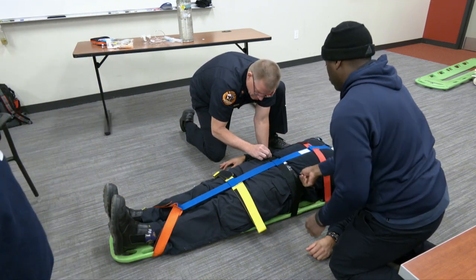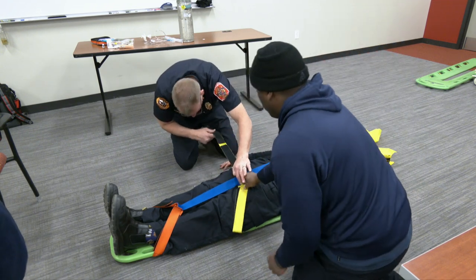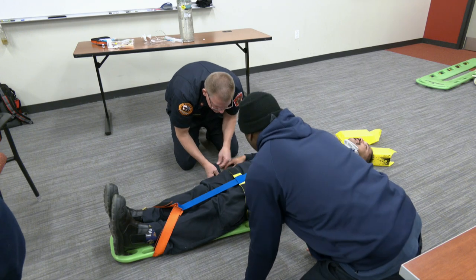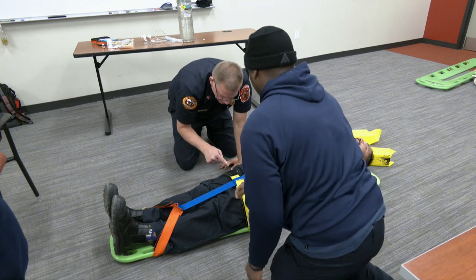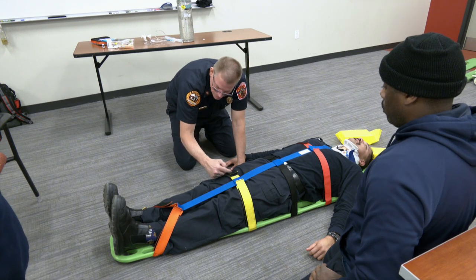Ready? Note that we're doing both sides at the same time. I want to leave it straight — I don't want to pull the patient to the side. Note that the straps have Velcro, so if they overlap, this one will go over the top of that one.